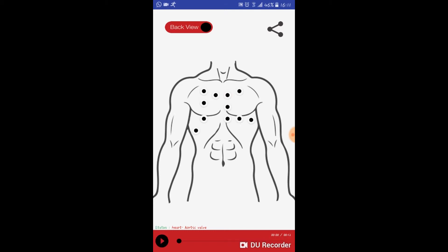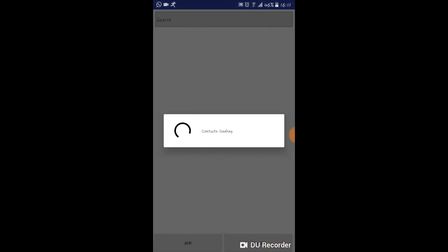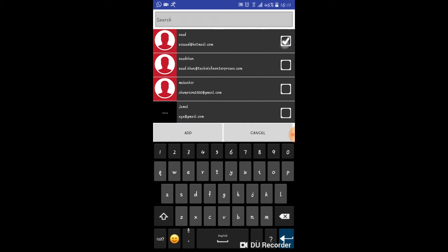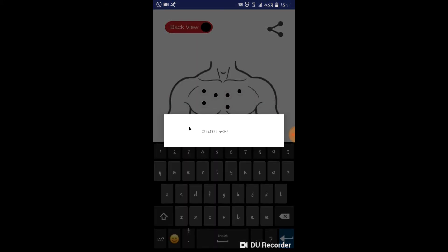There's an option to share your heartbeats with the doctors that are in your contact list by simply clicking on the share button.